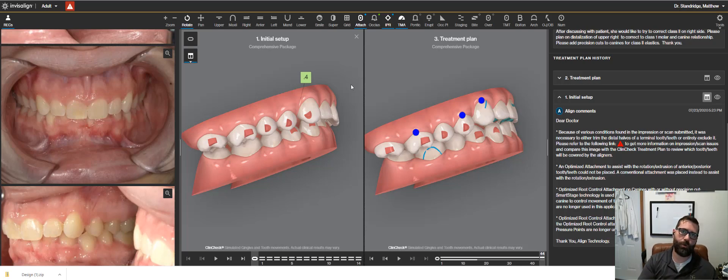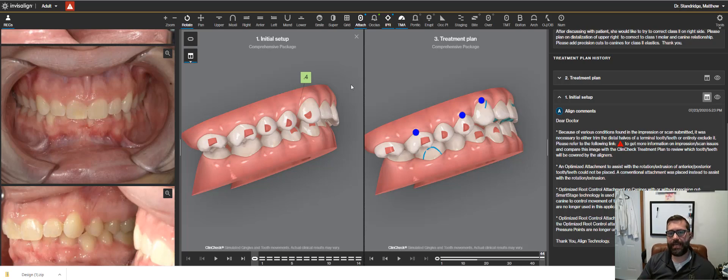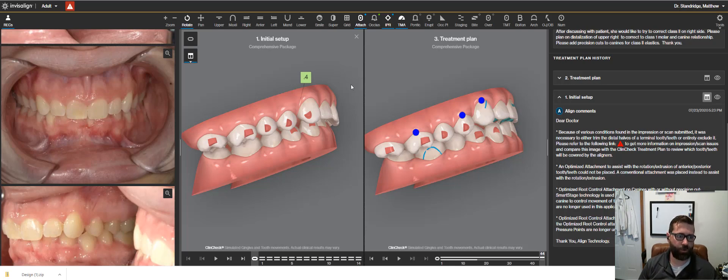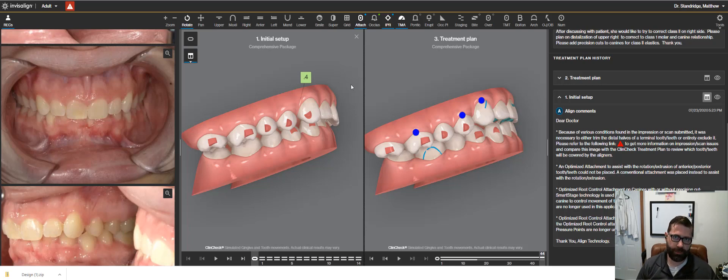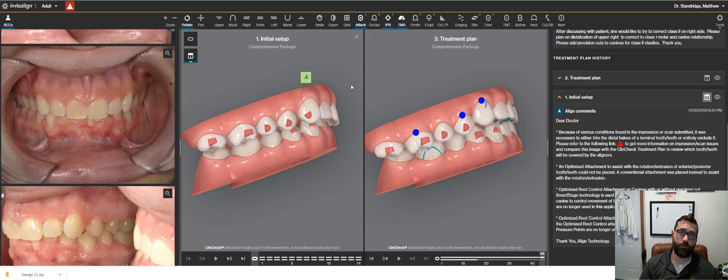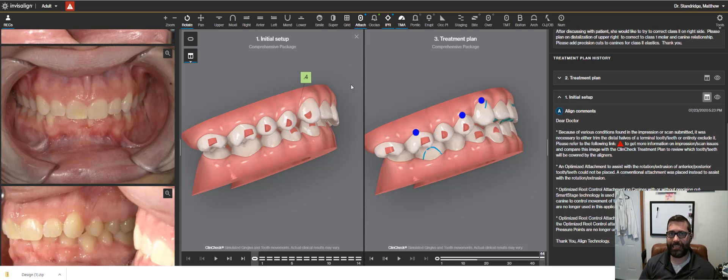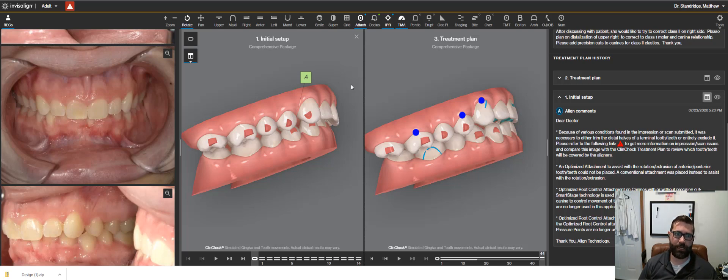She wanted to kind of idealize her bite some more. So I'm going to be showing some mechanics that takes it out of just the cosmetic Ortho because basically there's two ways to go about this. You could have just opened up the bite and left her with more overjet or you could idealize the bite. We chose to idealize the bite.